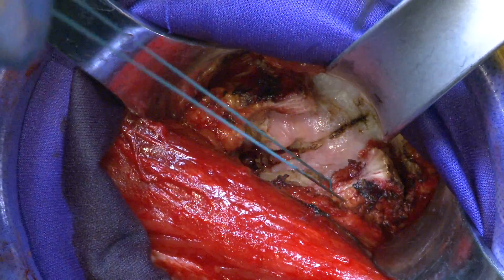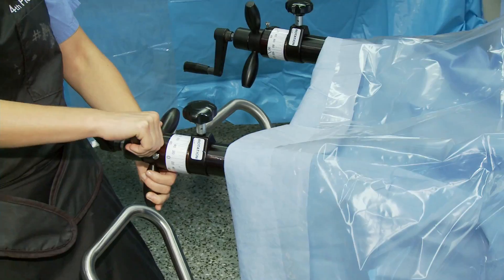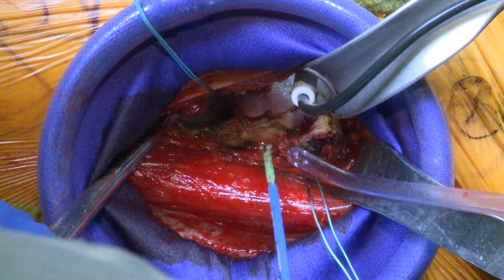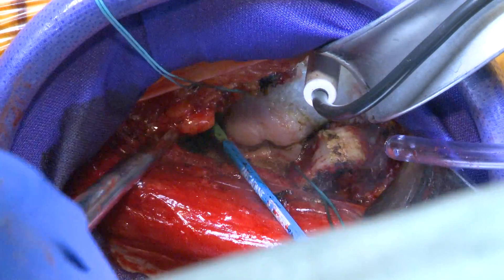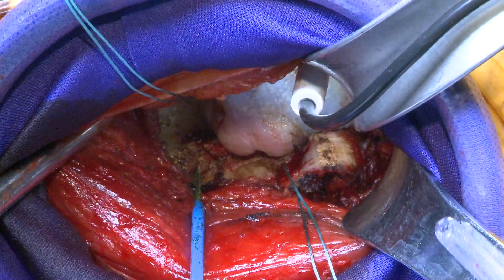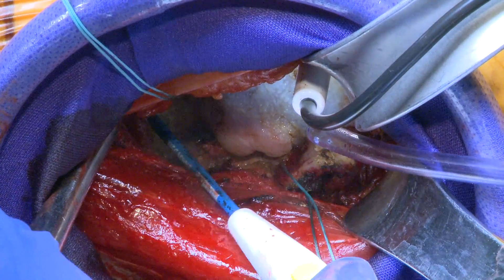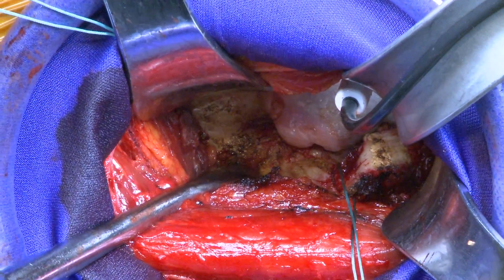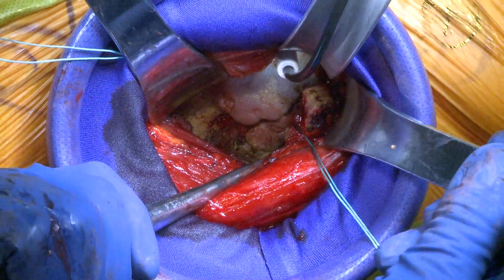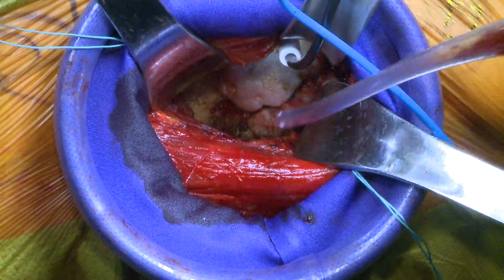Some people excise the capsule — that's a fine way to do it as well and makes visualization a little bit easier. I'm coming along the medial neck with the medial limb of the capsule, trying to get all the way around the medial neck and posteriorly — ideally I could see the lesser trochanter. I've opened the capsule medially and now we're doing the same thing laterally so we have full exposure of the neck. The retractors that started outside the capsule are now inside the capsule.